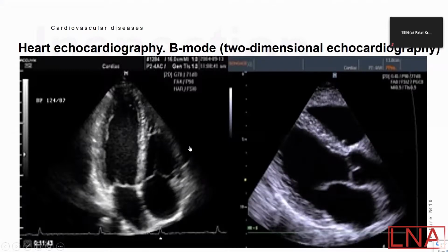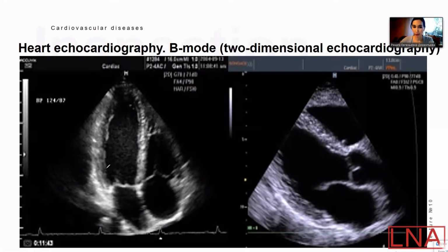So look, some other pictures with echocardiograms. The chamber of the left ventricle, the biggest, yes. Left atrium, right atrium, right ventricle. Also the direction of opening of the cusps of the valves, in the tricuspid valve.